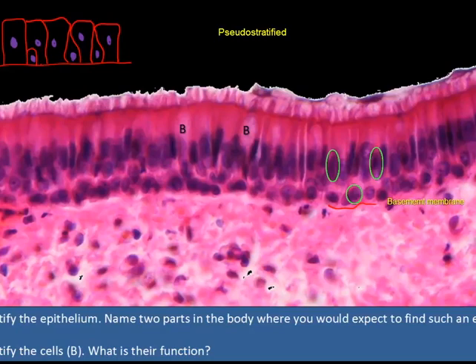So they create the illusion of cellular stratification. The tall cells, as you can see here, are the most numerous, so that's why it's called a columnar epithelium. The tall cells are also ciliated. So the official name of this epithelium is pseudo-stratified columnar ciliated epithelium.